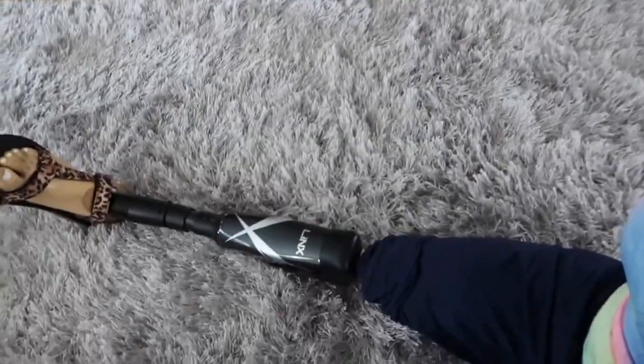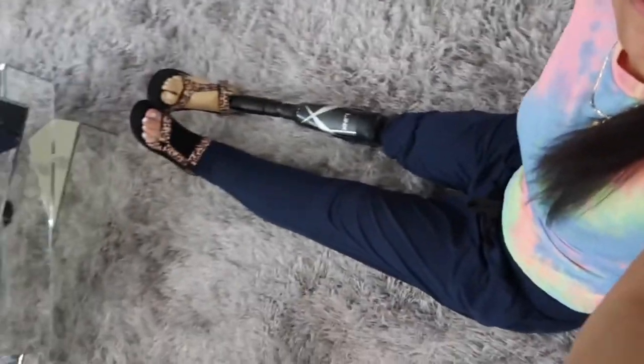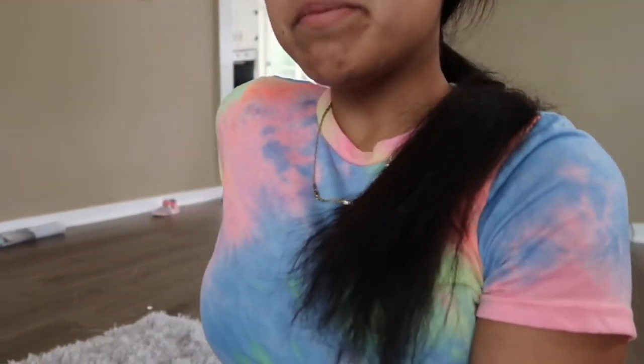It's in position. I can also sit like this with my legs out, but for me, it's not as comfortable. I don't know about other amputees. For everybody, it's different. Everybody finds their way to be comfortable while sitting, while standing, while walking. But hang on tight, I'll be right back. I'm going to show you another way that I do use my rotator.